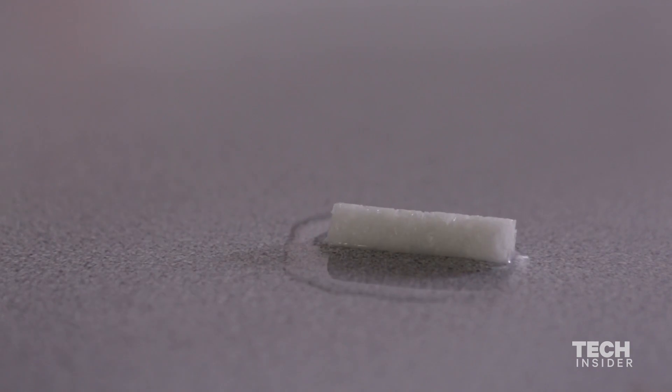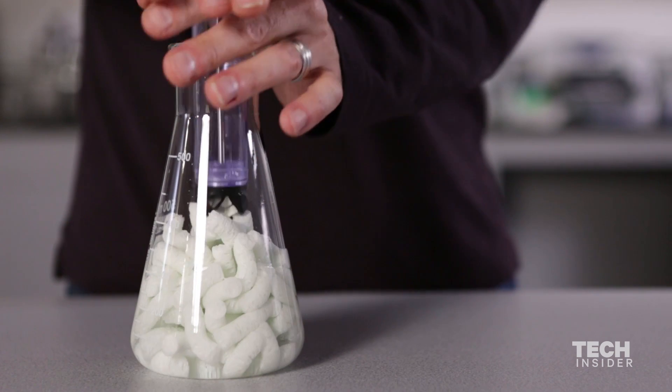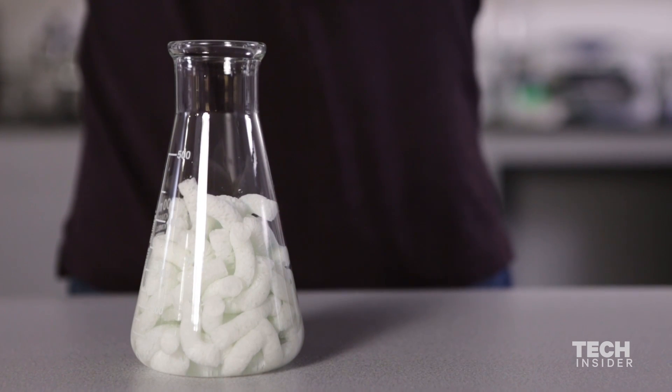they rapidly expand, and in doing that they fill up the wound and are able to compress it and essentially block the bleeding.